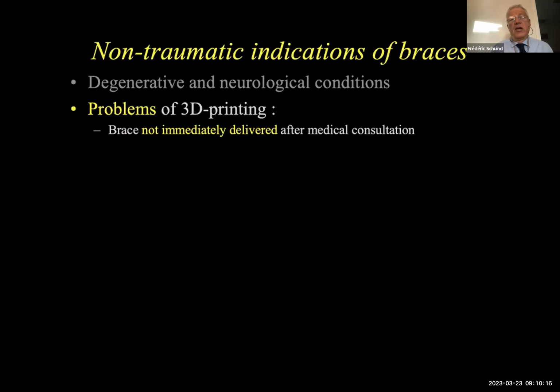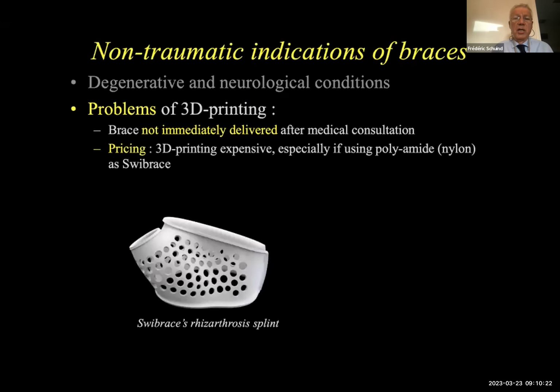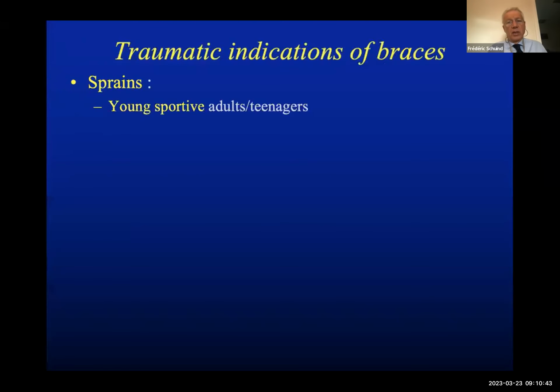Problems is, of course, that the brace, as compared to over the shelf, is not immediately delivered after the medical consultation. Pricing also, because 3D printing, at least with the nylon that we use, is expensive. Slide. And of course, in Europe, there is the medical device regulation, making this medical device not easy to put on the market. Slide. So these were the non-traumatic indications.